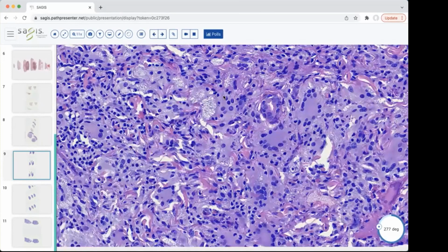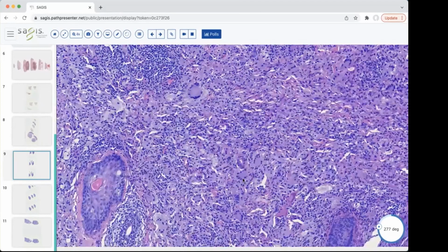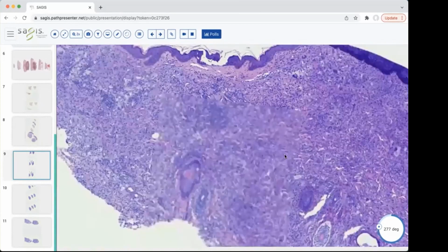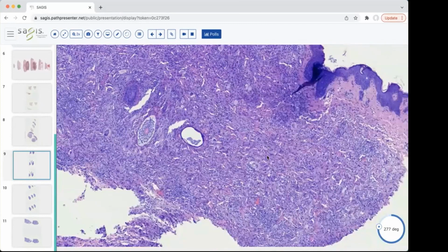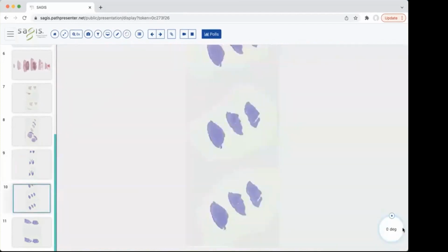I think noting that there's a granulomatous infiltrate with numerous Touton type giant cells, these scattered eosinophils as well, and the pattern of inflammation, the dense and diffuse inflammation, is really good for a xanthogranuloma. Remember that this is in the non-Langerhans cell histiocytosis family, of which there are many. But a good example here. Great. Okay, next case.